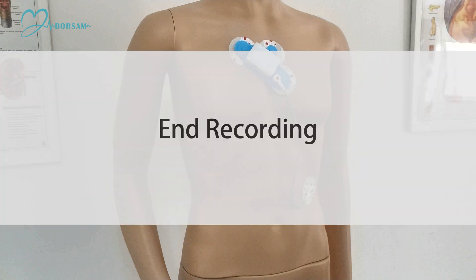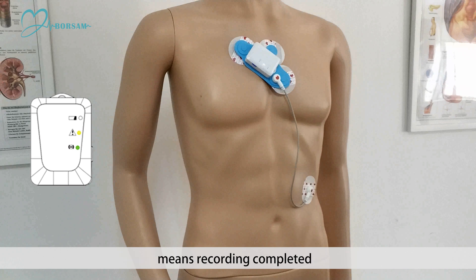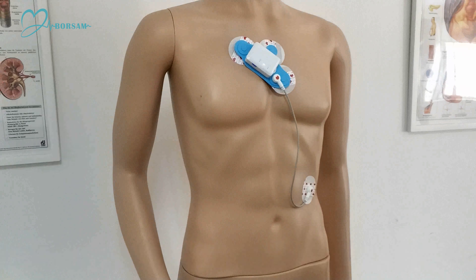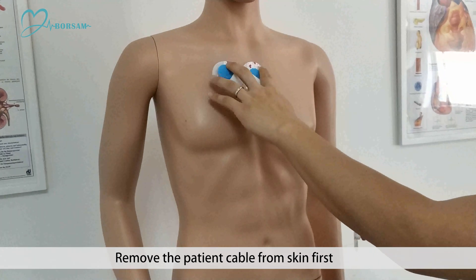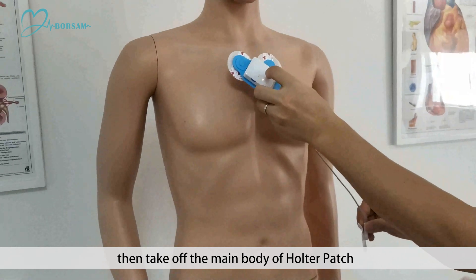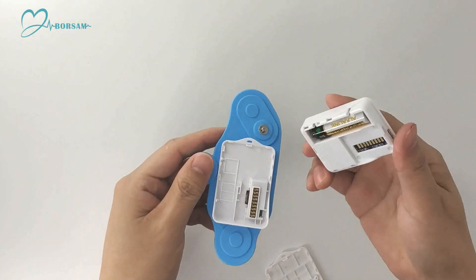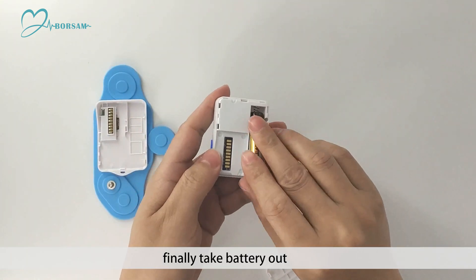End recording: when the yellow and green lights are on at the same time, it means recording is completed. Remove the patient cable from skin first, then take off the main body of the Holter patch. Finally, take the battery out.